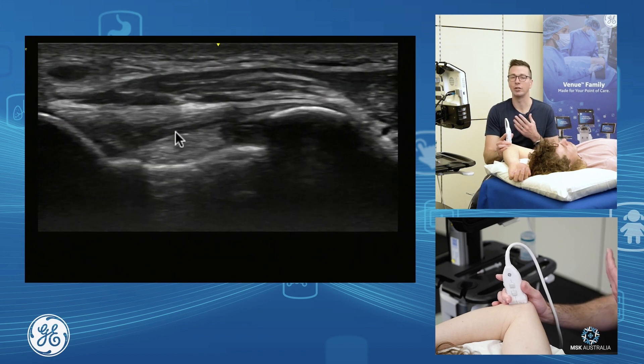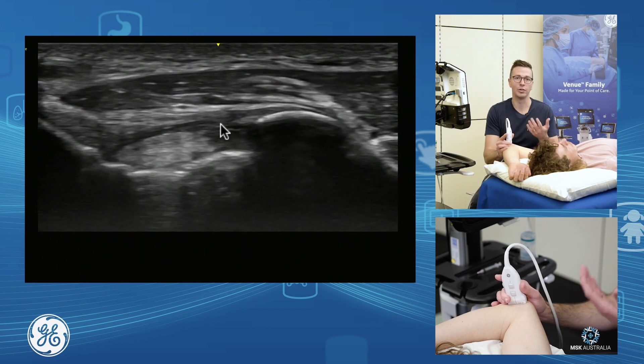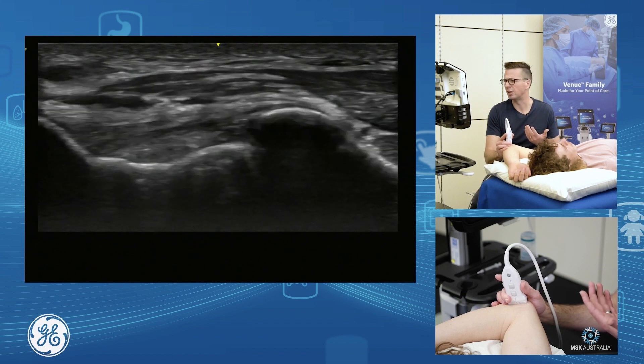We see the fat and joint space underneath. So if you had an effusion or haemarthrosis, this is where you'd see it medially. Loose bodies of the elbow often sit in here as well, quite commonly.